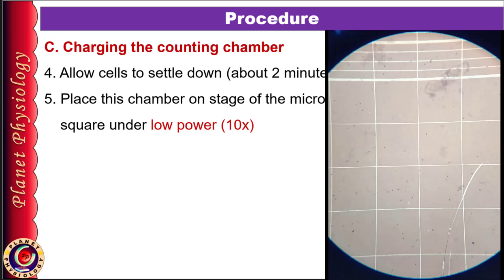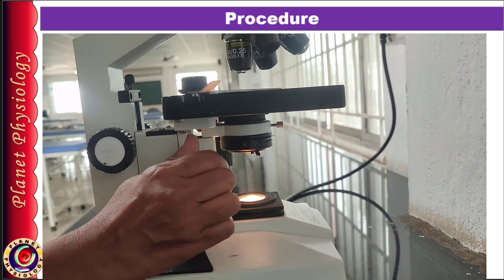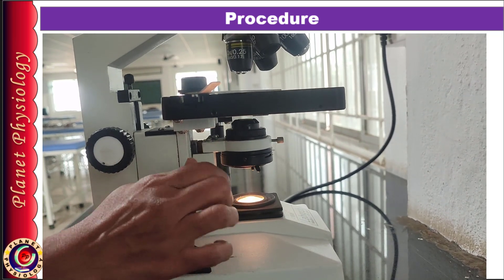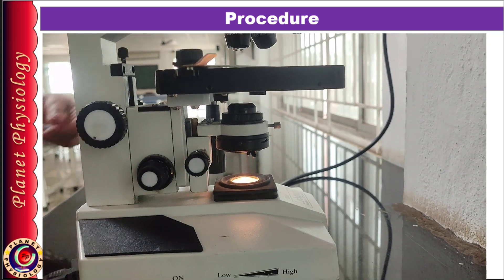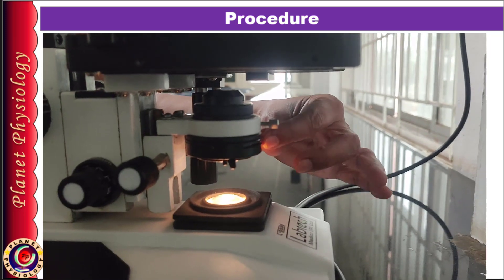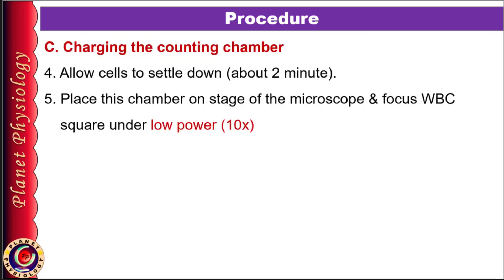WBCs appear like tiny black dots. Make sure the condenser is at the lowest position and the diaphragm is slightly open — this allows easy visualization of the cells. If the light is too bright, you may not be able to visualize any WBCs.